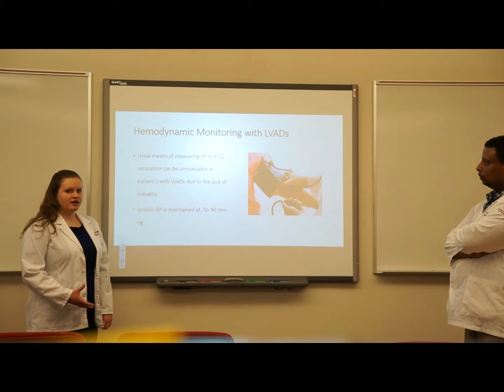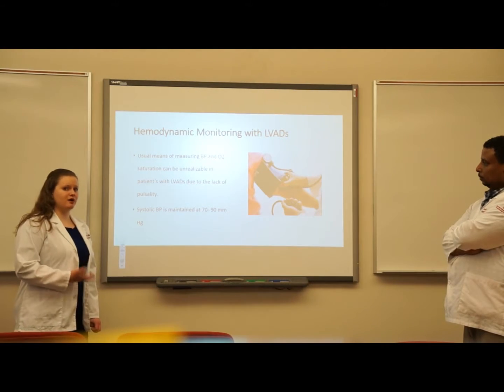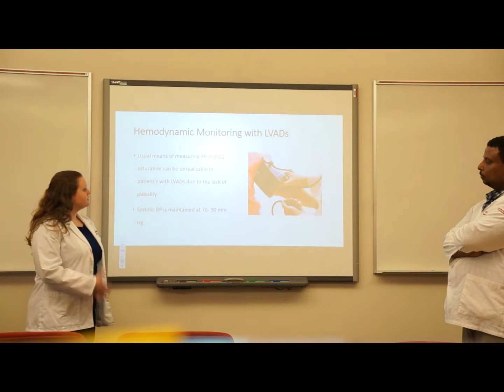Hemodynamic monitoring in LVAD patients is different from monitoring a patient who has a regular heart without the LVAD.